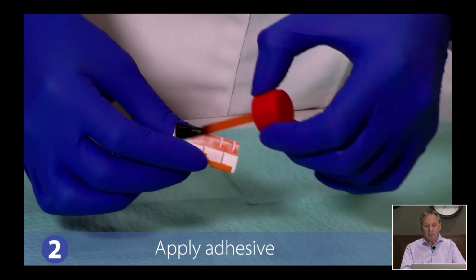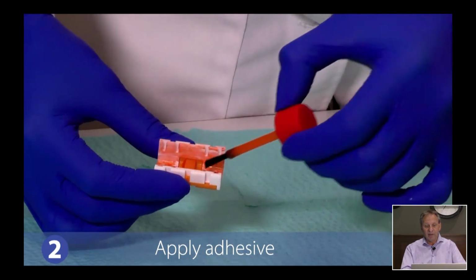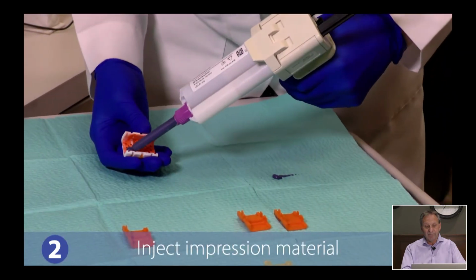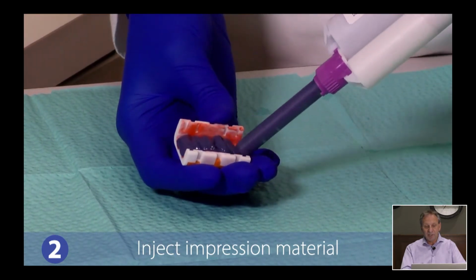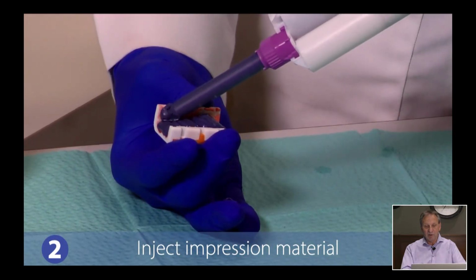Now again, what impression material can you use here? Pretty much anything. I like Impregum. That's what we use for polyvinyl, polyether type impressions, crown and bridge impressions. We've tried bite material, which is more rigid, but almost too rigid. So I'm back now to using Impregum impression material. But different materials potentially would work, depending on what your preferences are.